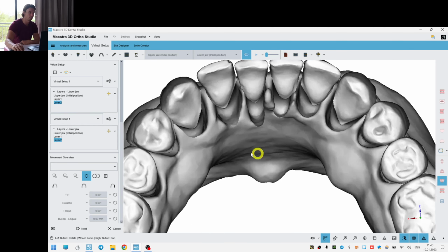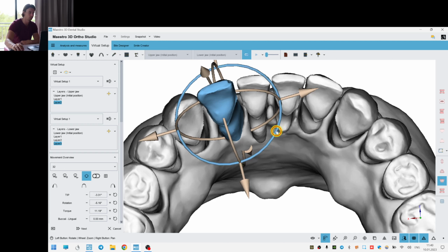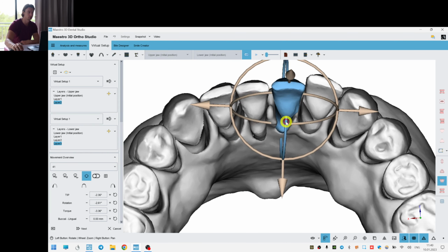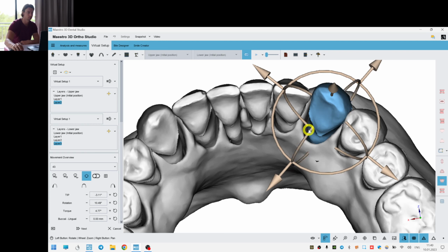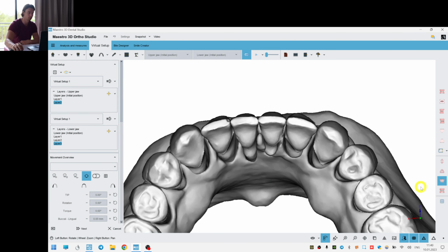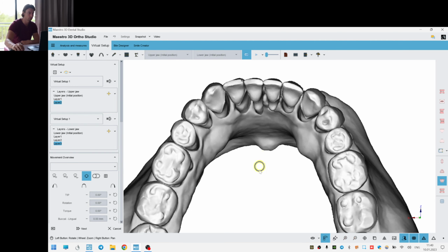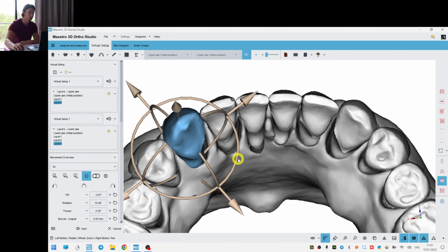And let's finish with the incisors by creating the final layer. Let's just distribute this space between all the teeth. Here I don't like the torque, so we'll add some lingual translation, but I'm not sure if it can work for real, because we see the root is too long. But we can try. It's not a big deal for us to make a trial.